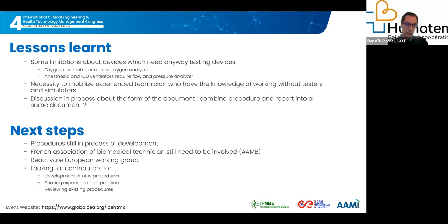We have also found out that we need to involve very experienced technicians who have the knowledge to work without testers and simulators, and for example, most of them are retired. The new generation of biomedical professionals is used to working with these very useful testers and simulators. So it's very important also to involve in the network these technicians who have been experienced for a long time.